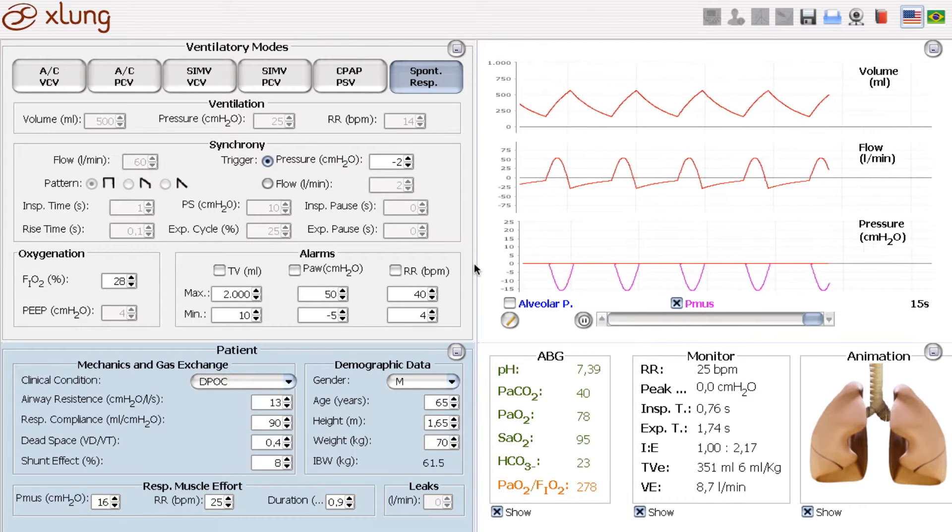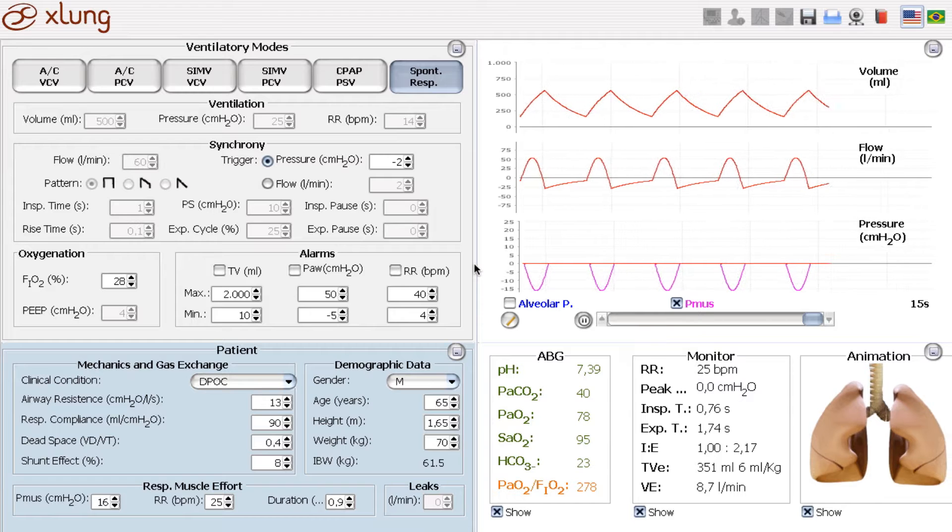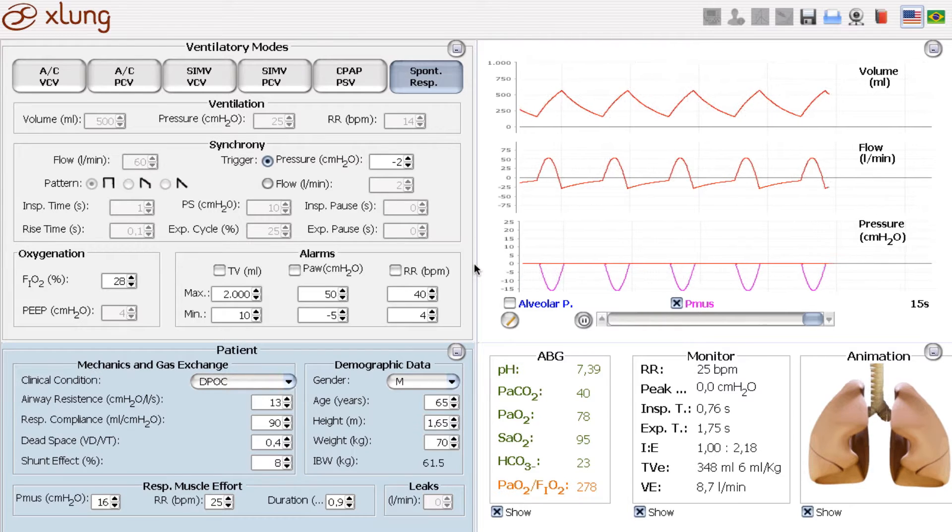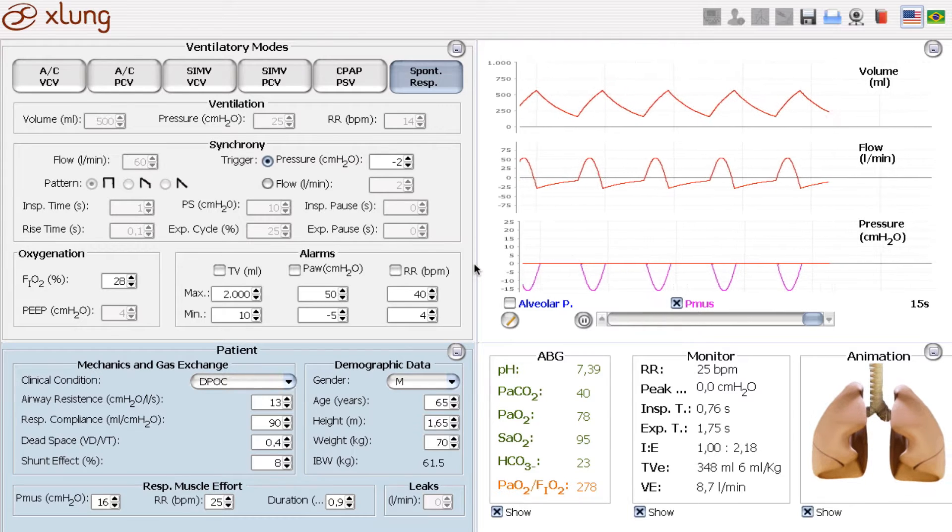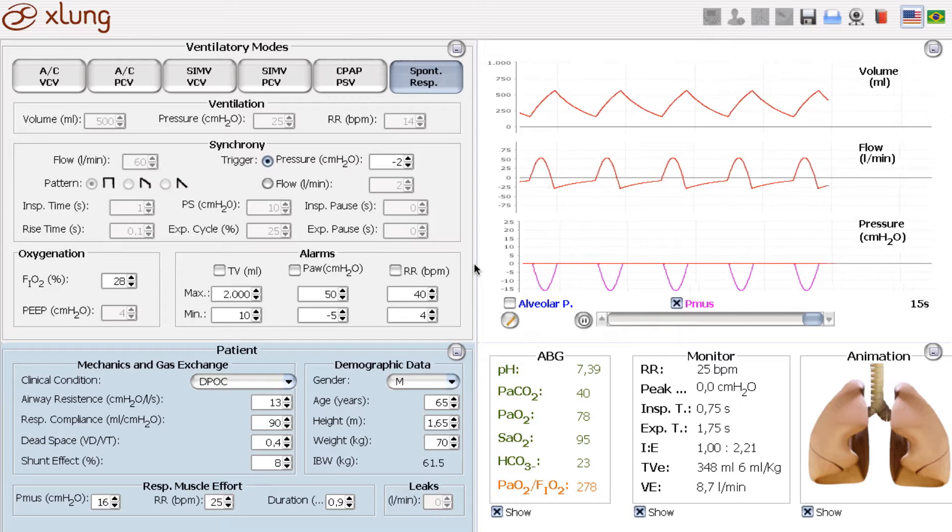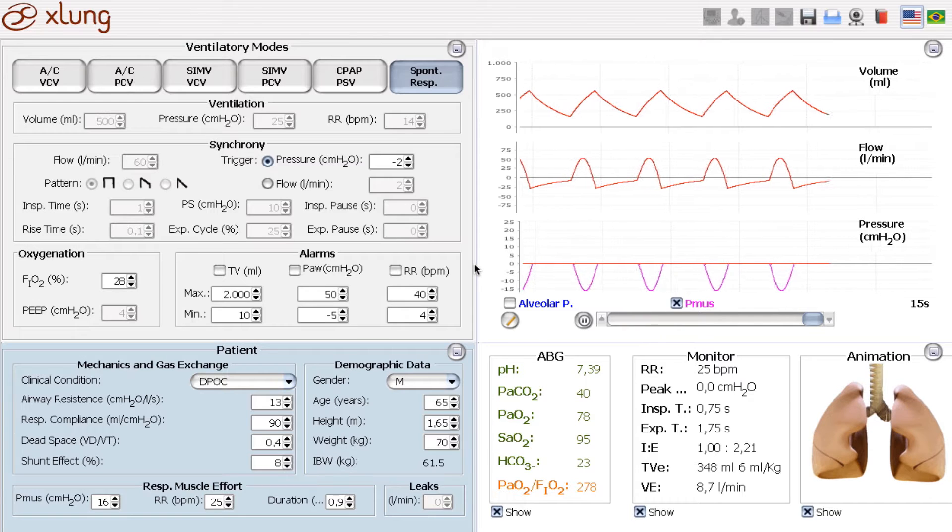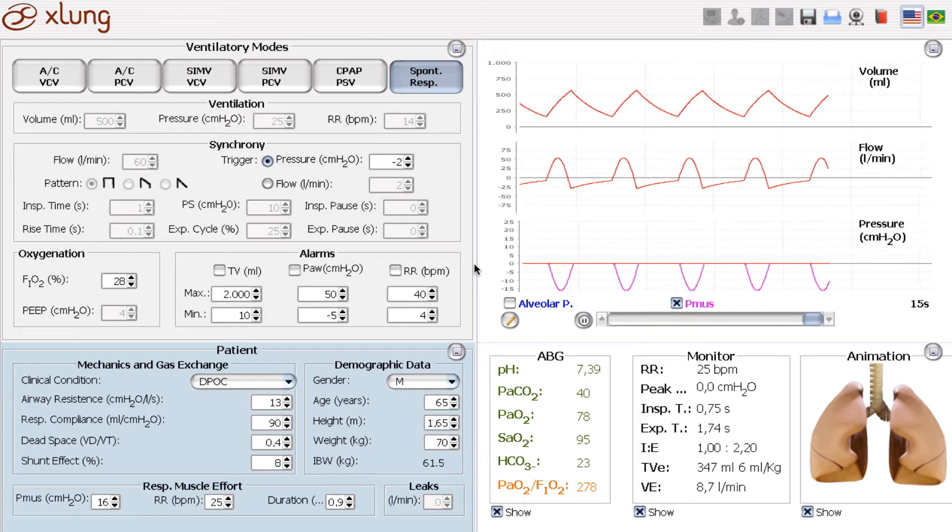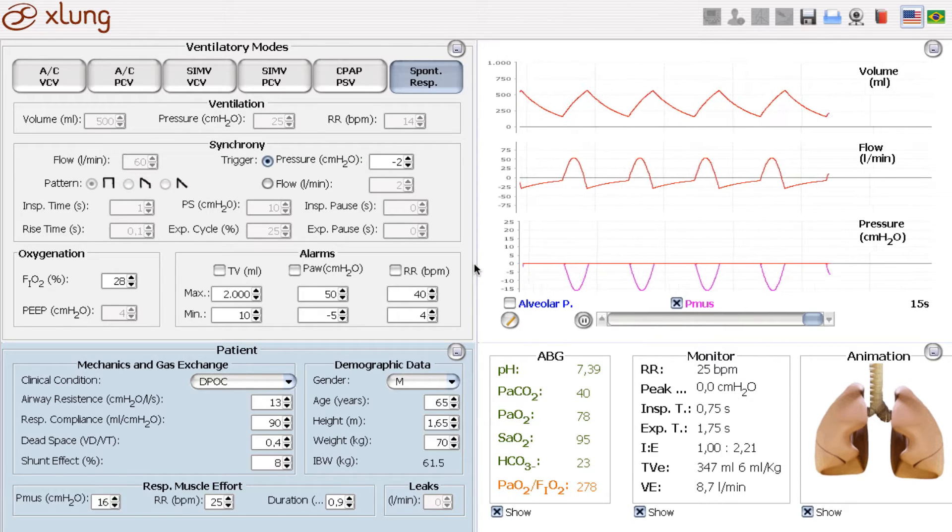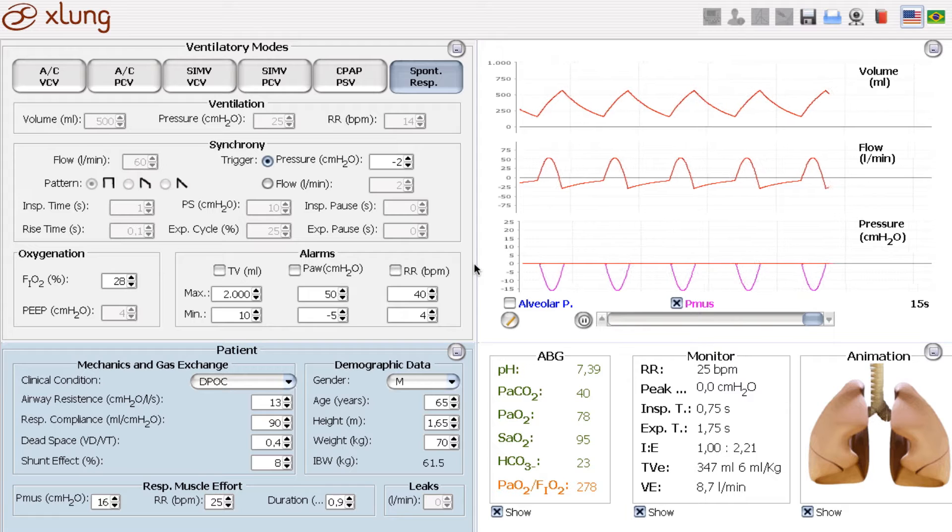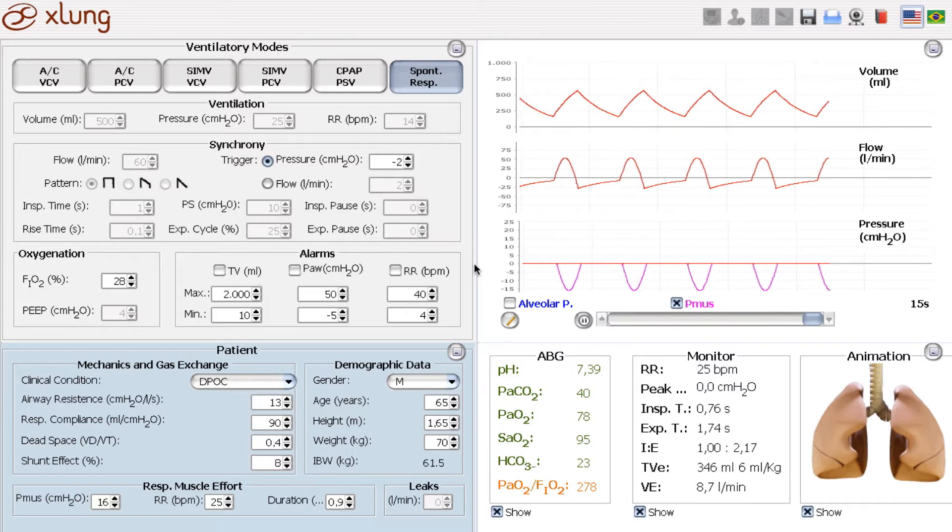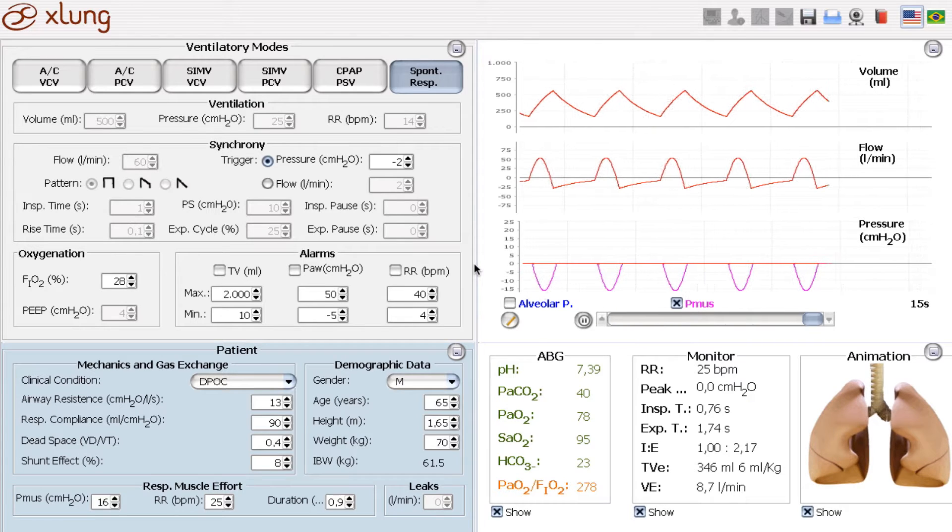Here we have a COPD patient which is in the hospital for a surgical procedure, for example. And we will simulate an exacerbation of his disease.